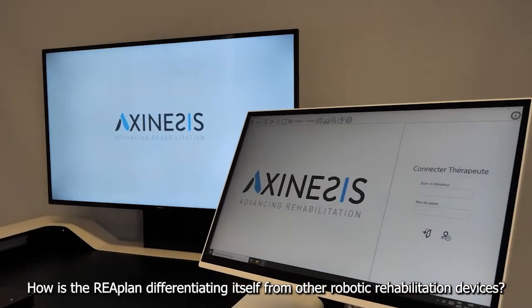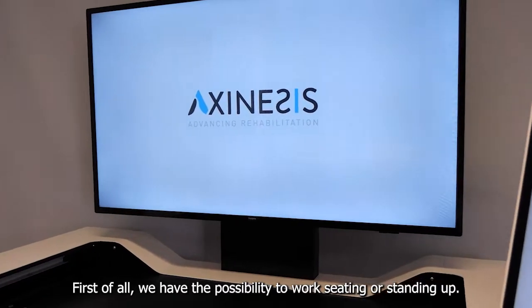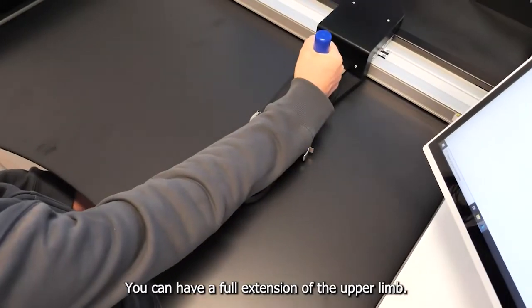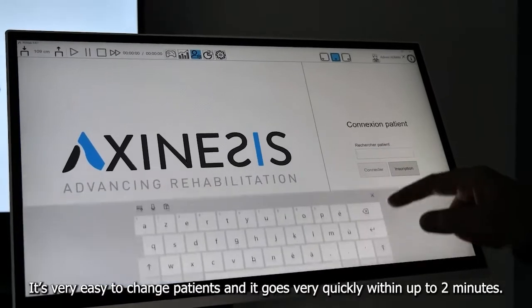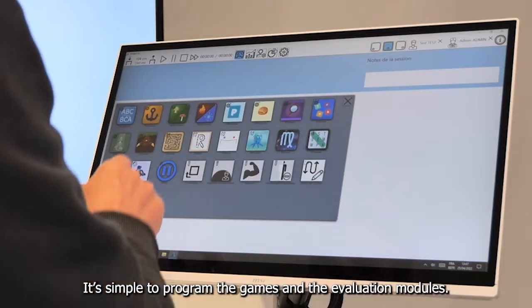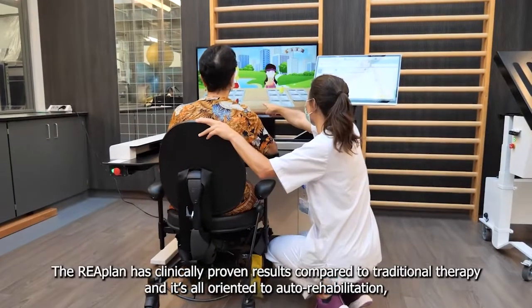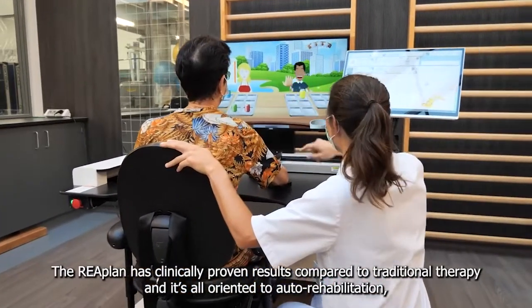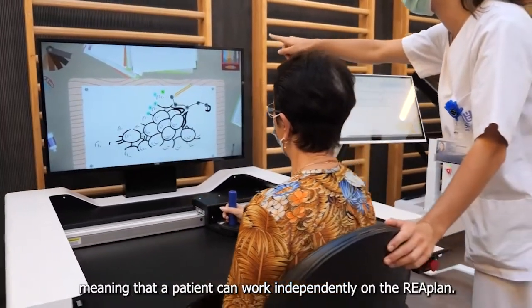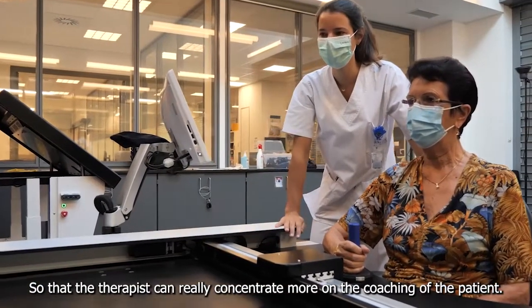How does the Reaplan differentiate itself from other robotic rehabilitation devices? First, you have the possibility to work sitting or standing up, with a full extension of the upper limb. It's very easy to change patients, taking up to two minutes. It's simple to program the games and evaluation modules. The Reaplan has clinically proven results compared to traditional therapy, and is oriented to self-rehabilitation, meaning the patient can work independently so the therapist can concentrate more on coaching the patients.